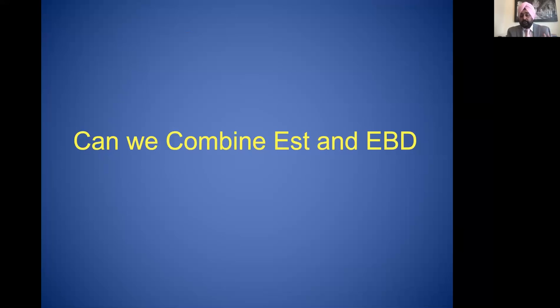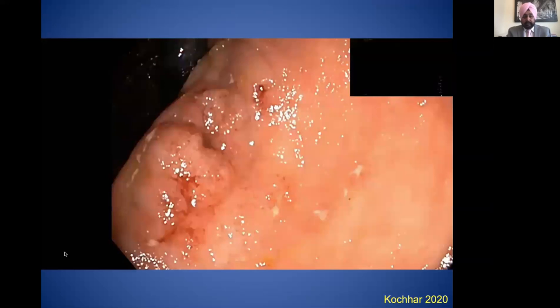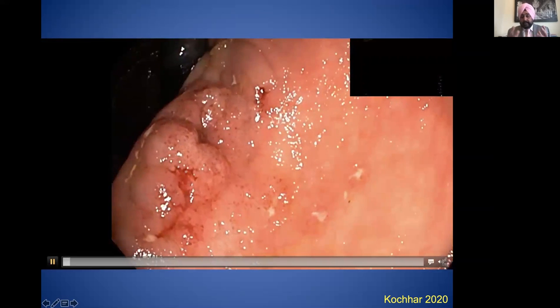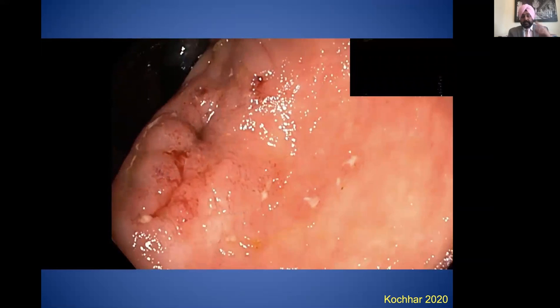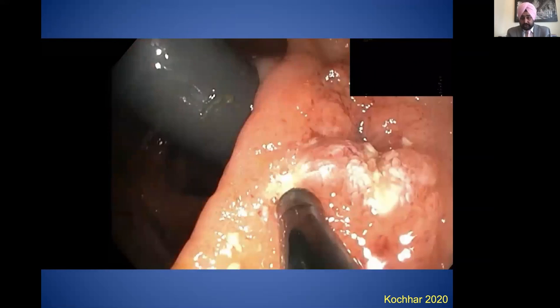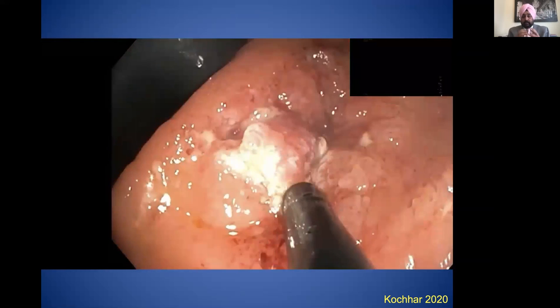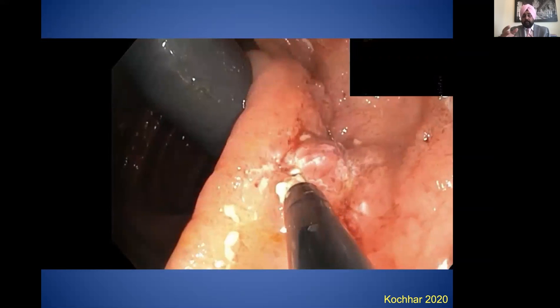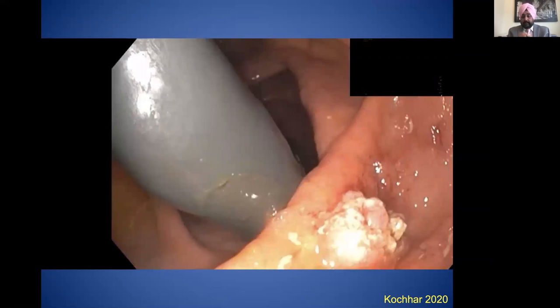Can we combine stricturotomy and balloon? Yes, I have done that. In this video, we will share a difficult, tough stricture at an ileocolonic anastomosis. I initially started to do a knife incision, and I was trying to cut, looking at the fibrous tissue. I was not able to find the fibrous band because the lumen of the small intestine kept prolapsing out.